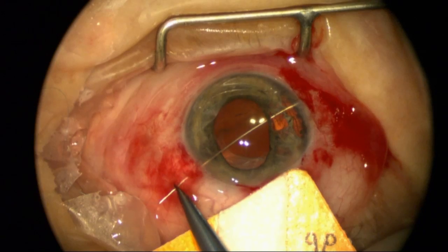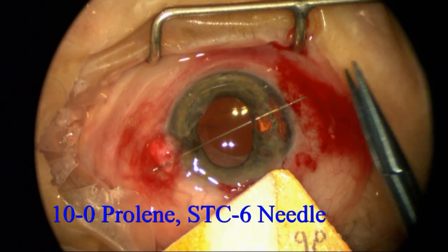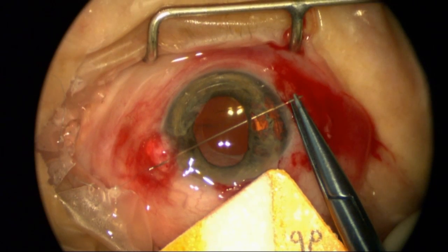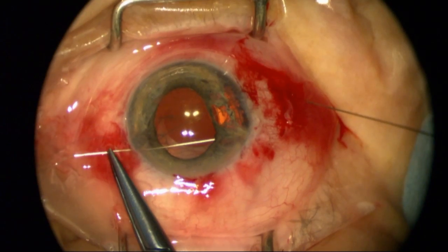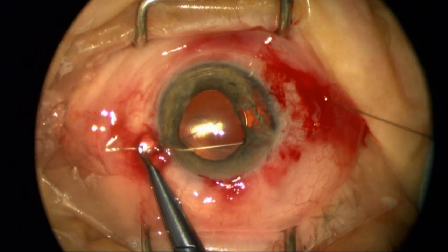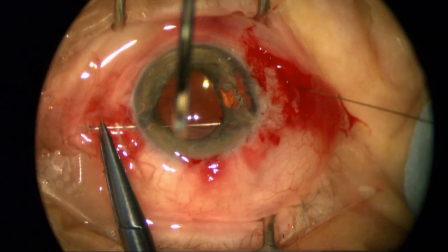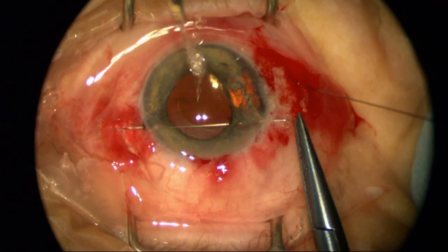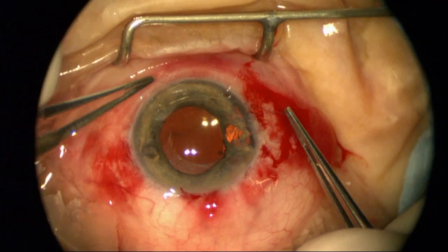Now I'm going to use an STC6 needle on a polypropylene suture to try to reduce that opening in the iris and reduce the glare it's causing. I'll also re-center the pupil. The pupil is pharmacologically dilated right now, but when this patient is not dilated — given a light-colored iris — the family can see that the pupil is de-centered nasally.